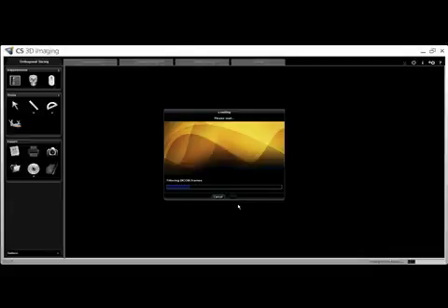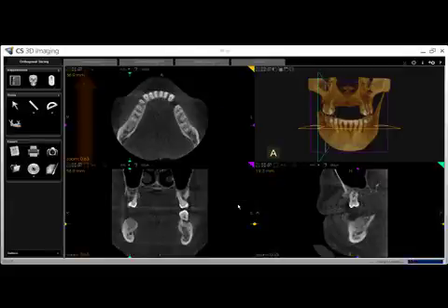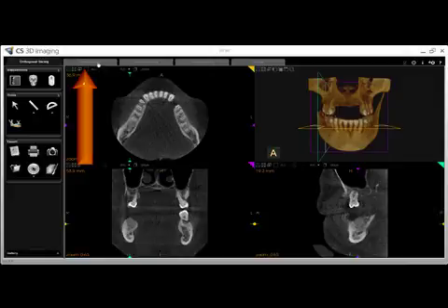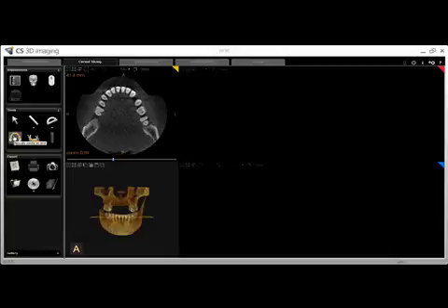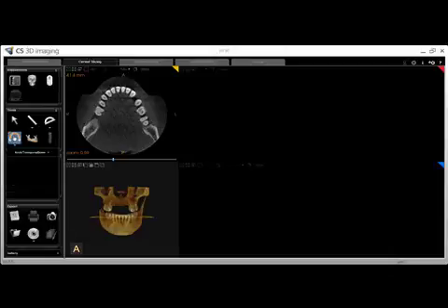Once open, we must move to the Curve Slicing tab to use the implant module. Once you move to Curve Slicing, you will need to be sure that a panoramic curve has been drawn. To draw a panoramic curve, or if your software has automatically created one and you wish to redraw it, simply click the Arch Curve tool.